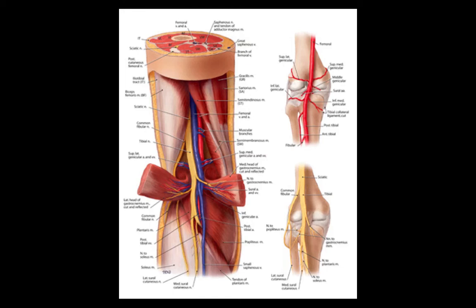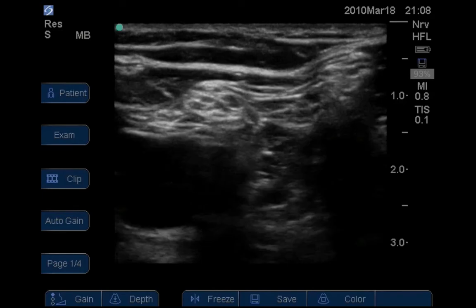So the big advantage of using ultrasound to block this nerve is that you can see where the two nerves separate, come a little bit proximal to that, and then you can confidently get both components of the nerve with one injection. So this is one block.